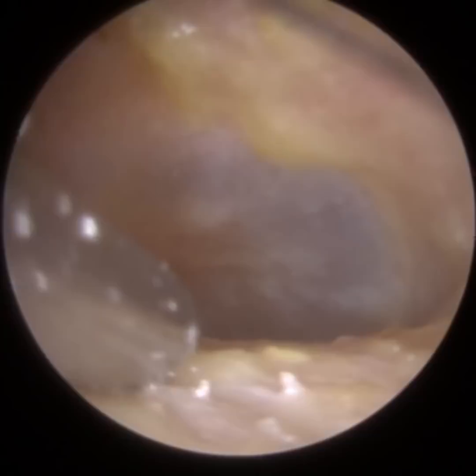You can just see there — the eardrum is fully visible. I'm going to try to mop up as much of this dead skin off the canal wall. I think this dead skin has probably wilted because of all the drops — the patient had been using drops for a couple of weeks.